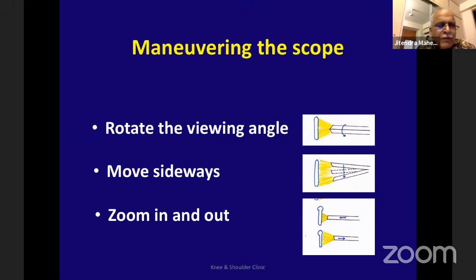But I'll tell you, the water will still come under the skin. That thing will blow up. So it doesn't work that way. So if it is a problem, I think better is to put a cannula inside. If you don't have a cannula, you can put the stitch. Water may not come out, but it will all accumulate under the skin. It will become a big bump there, unless you close the capsule, which you cannot close. Thank you, sir.